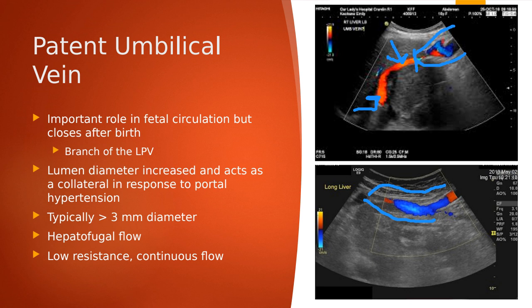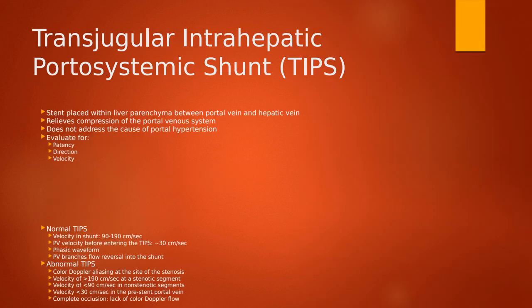TIPS. So you may have heard of this before. Techs don't like performing these exams because we don't do them too often. So they're a little bit challenging in terms of remembering what to do, what not to do, what's normal, what's abnormal, but it's not really anything crazy. If you're comfortable with doing abdomen Dopplers, you just have to know that it's a little bit different from that.